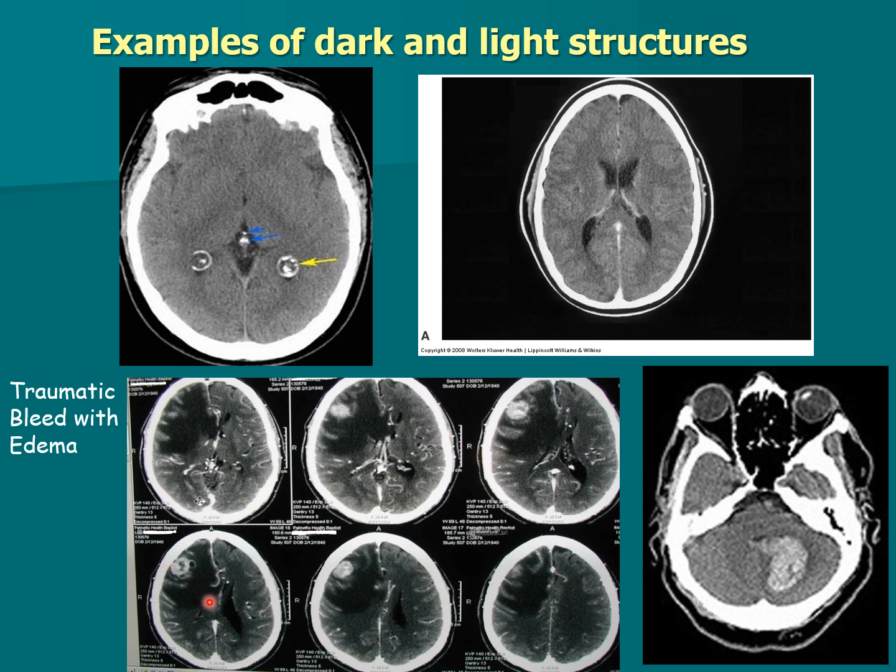And so now we do have some contrast in this one, and you can see that this is the brain bleed, but this has been bleeding for a long time because this brain has dissolved. This is an example of a recent bleed into the brain here, in the intracranial, the tissue inside the brain is bleeding here. So that white is bleeding here. The white here is bleeding, and the black is where the brain has dissolved.